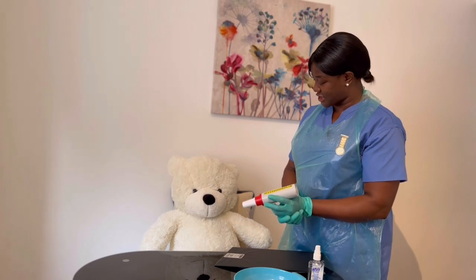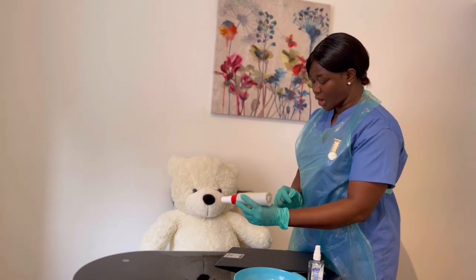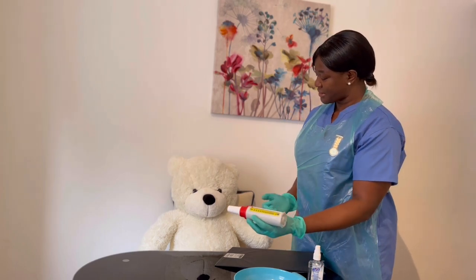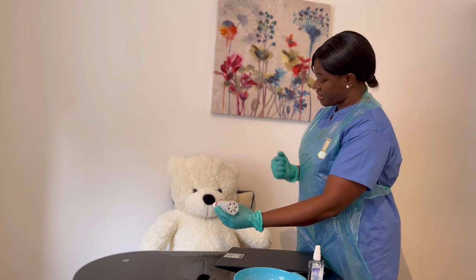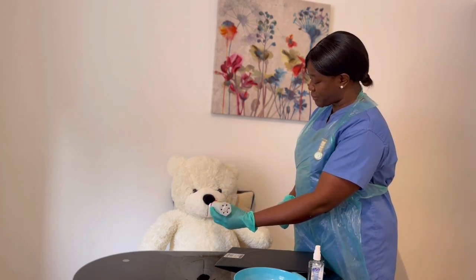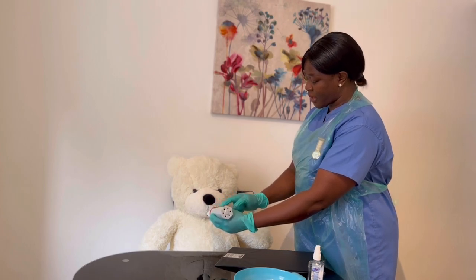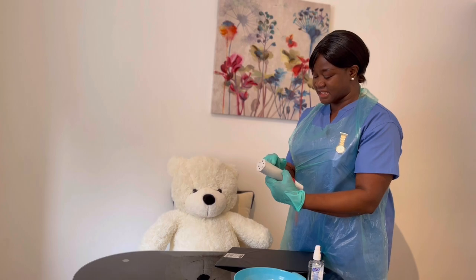Two minutes have passed. Are you ready for the third reading, Harry? Yes, nurse. You're sitting upright already. I'm sliding the marker back to zero. Can you take full inspiration? Your lungs are filled. Form a tight seal with your lips without your tongue covering the mouthpiece hole. Can you give a short sharp blow, as fast as you can. Wonderful. The third reading is 600.